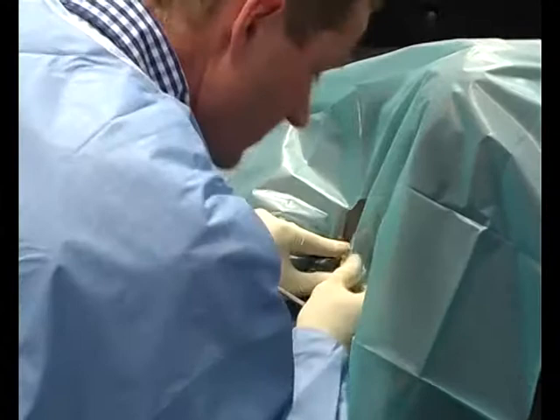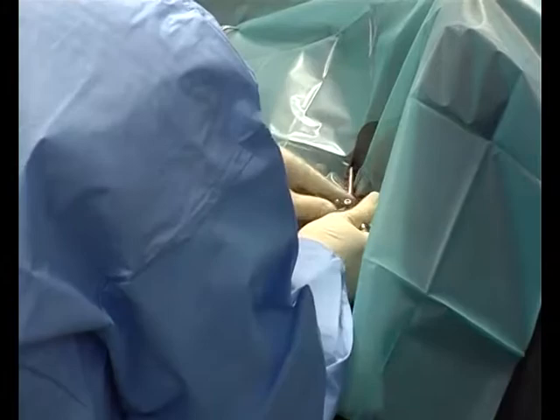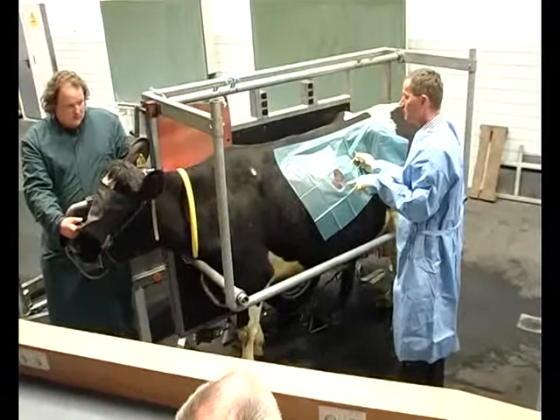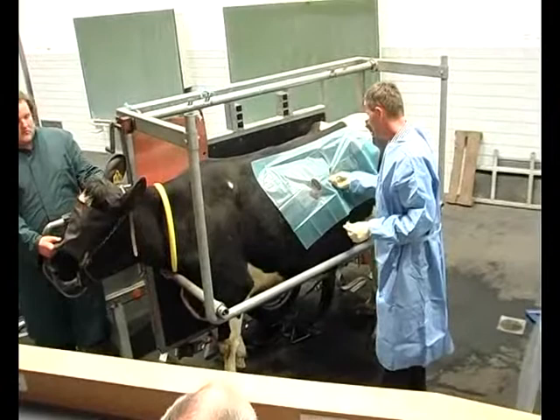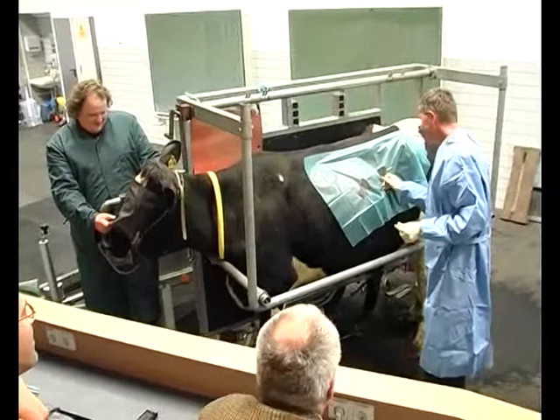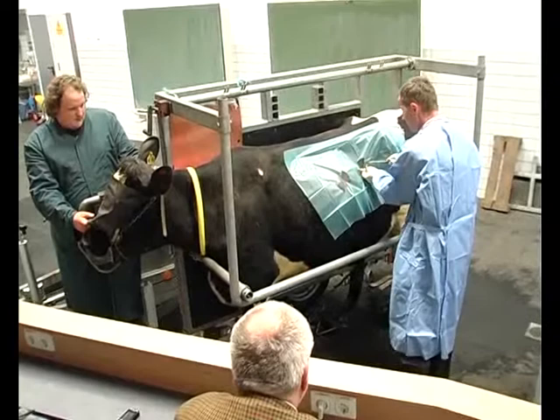But this is quite big, so I think I'll do it the way like Heinz. Now we change the position, we go straight into the abomasum. At a certain moment there is a turning point. Now air goes in, and at a certain moment this direction is to the other side. It's not optimal because this is a live demonstration. Normally there's a magnet valve inside, and we don't use the magnet valve, and the air has to go there.